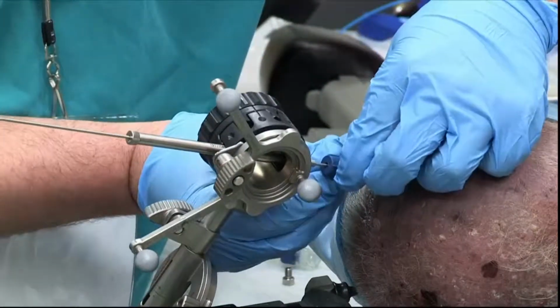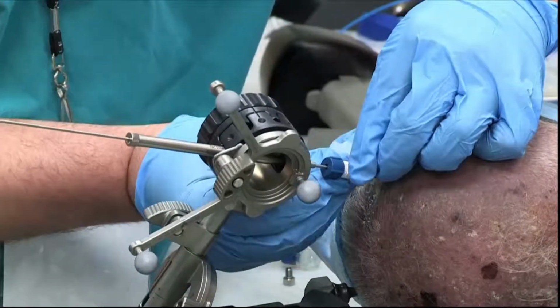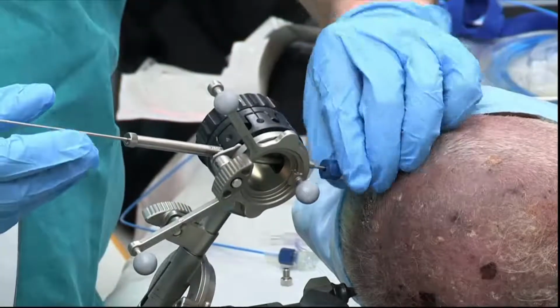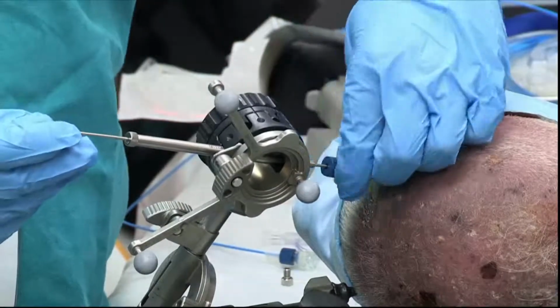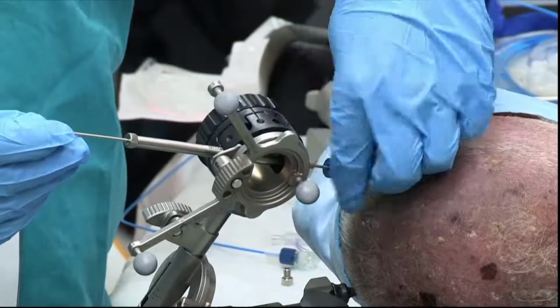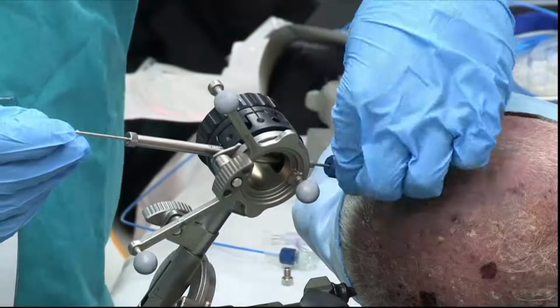So we can get this to sit. I think PMT also makes a bolt. We don't use that one or haven't used that one.